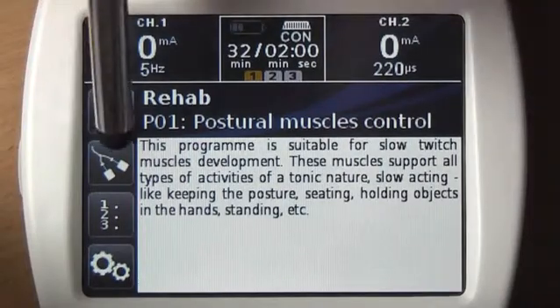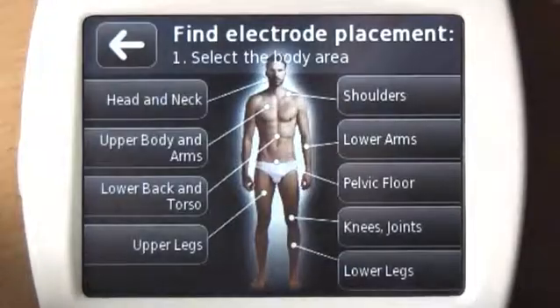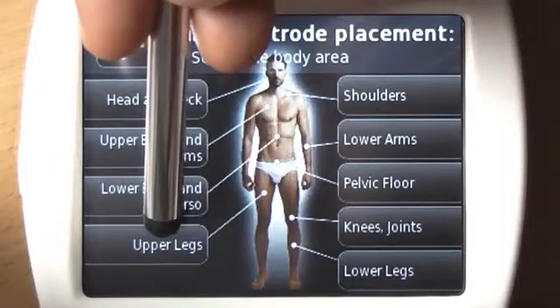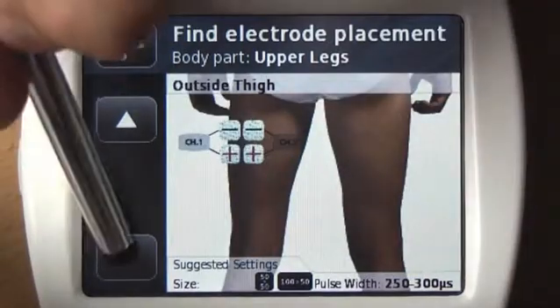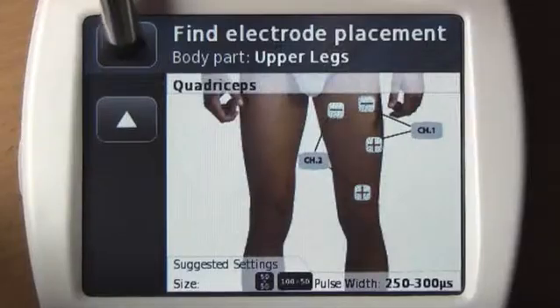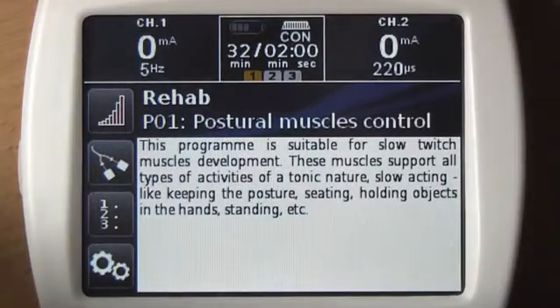In addition, there are several options to choose from. To review the electrode placement, press the electrodes button. Here you can select your body area, for example upper legs. Now press the arrow button to see the example of electrode positioning which the therapist would select carefully to suit the purpose of the treatment. Press the back arrow on the top left-hand side of the screen to go back to the help menu.